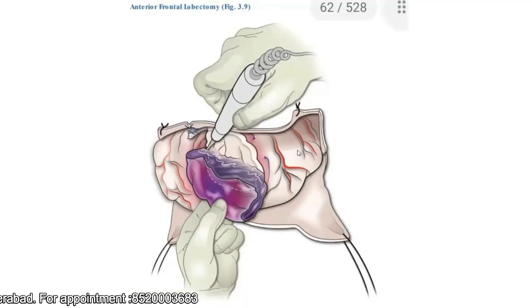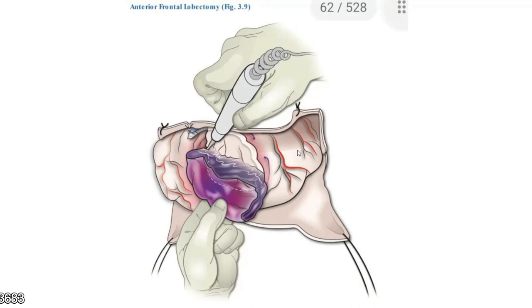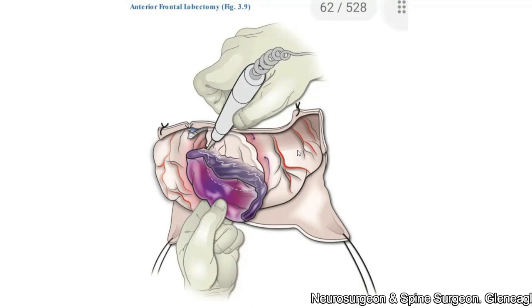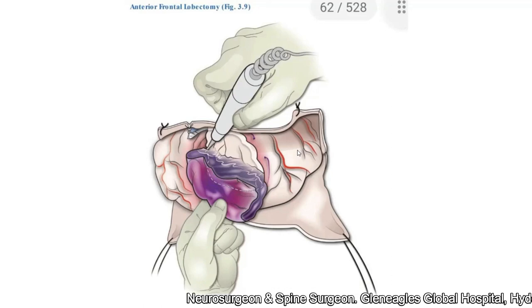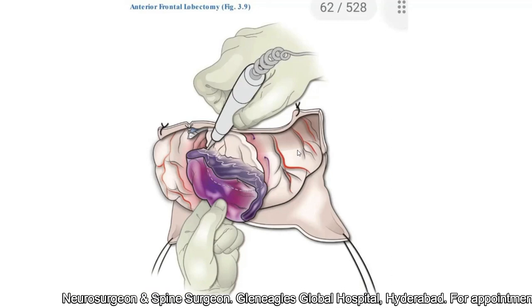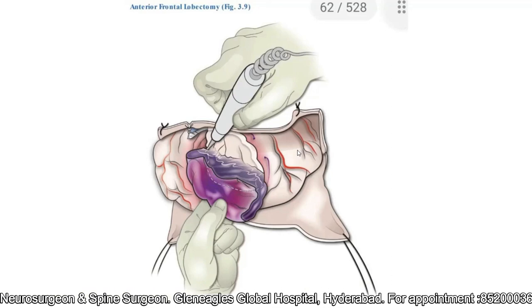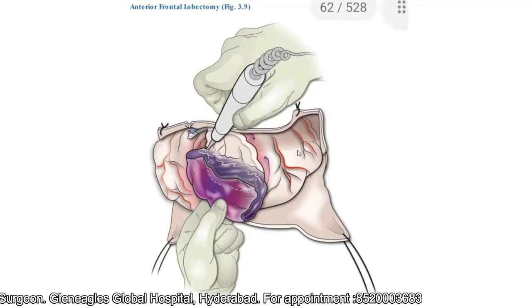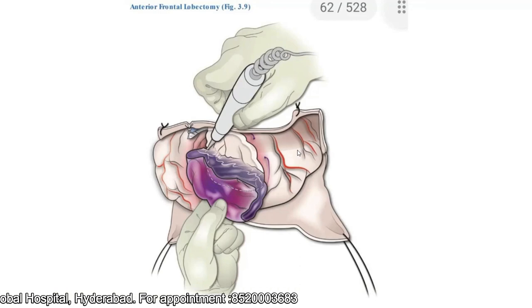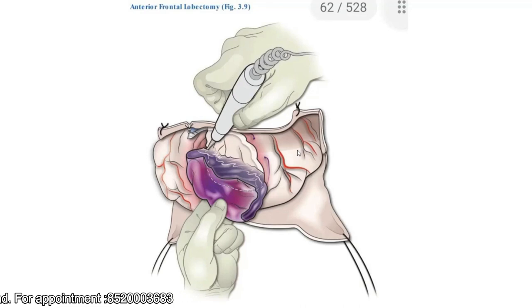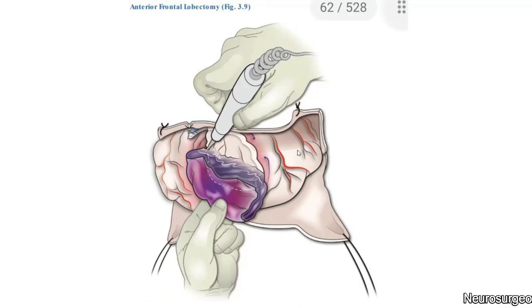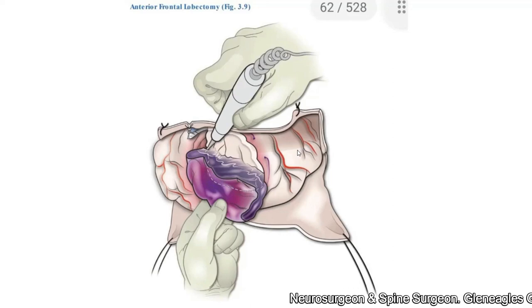Once hemostasis is achieved, the next steps are similar to the previous session: decide whether to perform a primary duroplasty, an expansile duroplasty, or just tack-up sutures with Gelfoam. Decide whether to replace the bone flap or preserve it elsewhere. Achieve hemostasis, place a closed suction drain, and close the skin in layers.